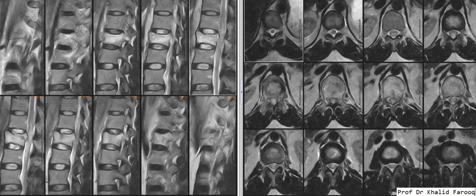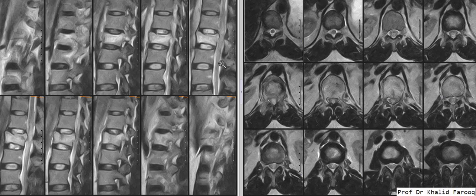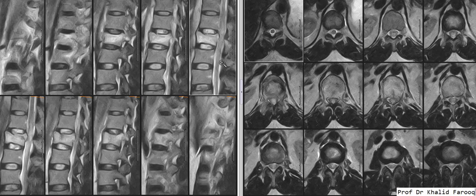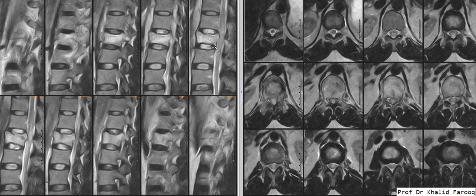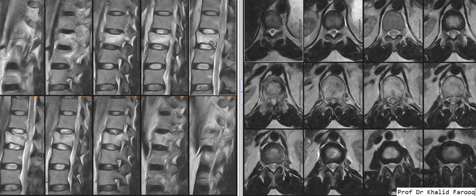Here we have a young patient who came with history of trauma. The patient presented with weakness of lower limbs and urinary incontinence. We can see there is a compression fracture of the T12 vertebra with mild reduction in its height.